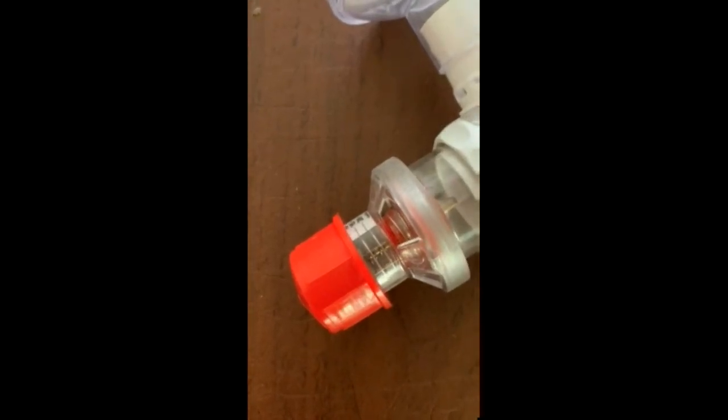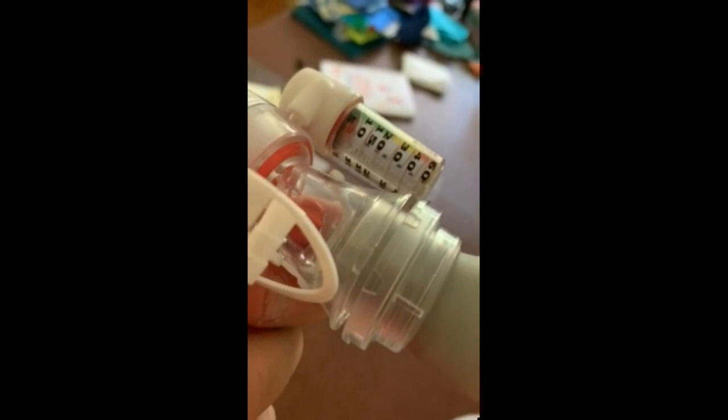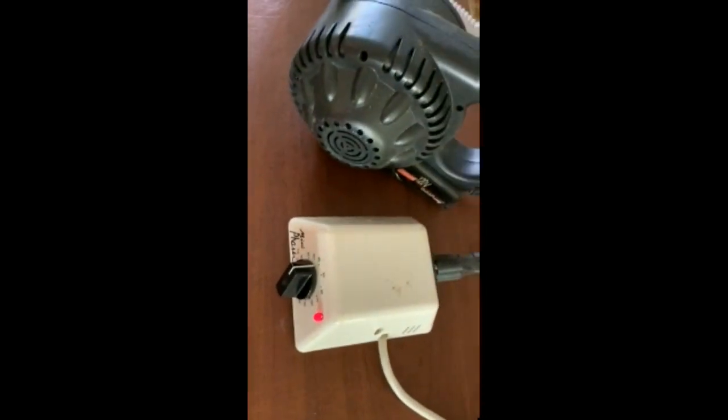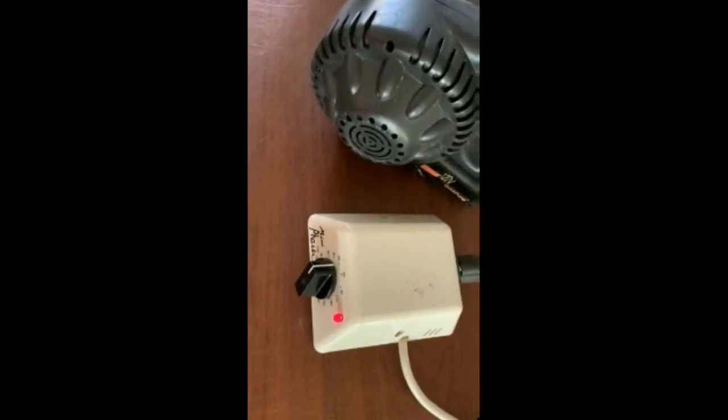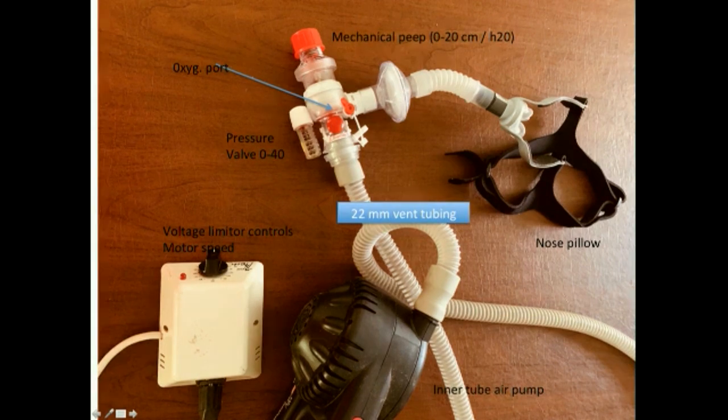Here is 10 of PEEP dialed in. Here is 10 of PEEP dialed in with the motor off. It goes to 10 on expiration. The motor is now turned on, and it remains at 10 to 12 throughout the respiratory cycle. The voltage controller has the motor running at about a third speed. It's a 120-volt motor. There is a filter between the patient and the Ambu bag valve mechanism, so air expelled at the PEEP valve is filtered.